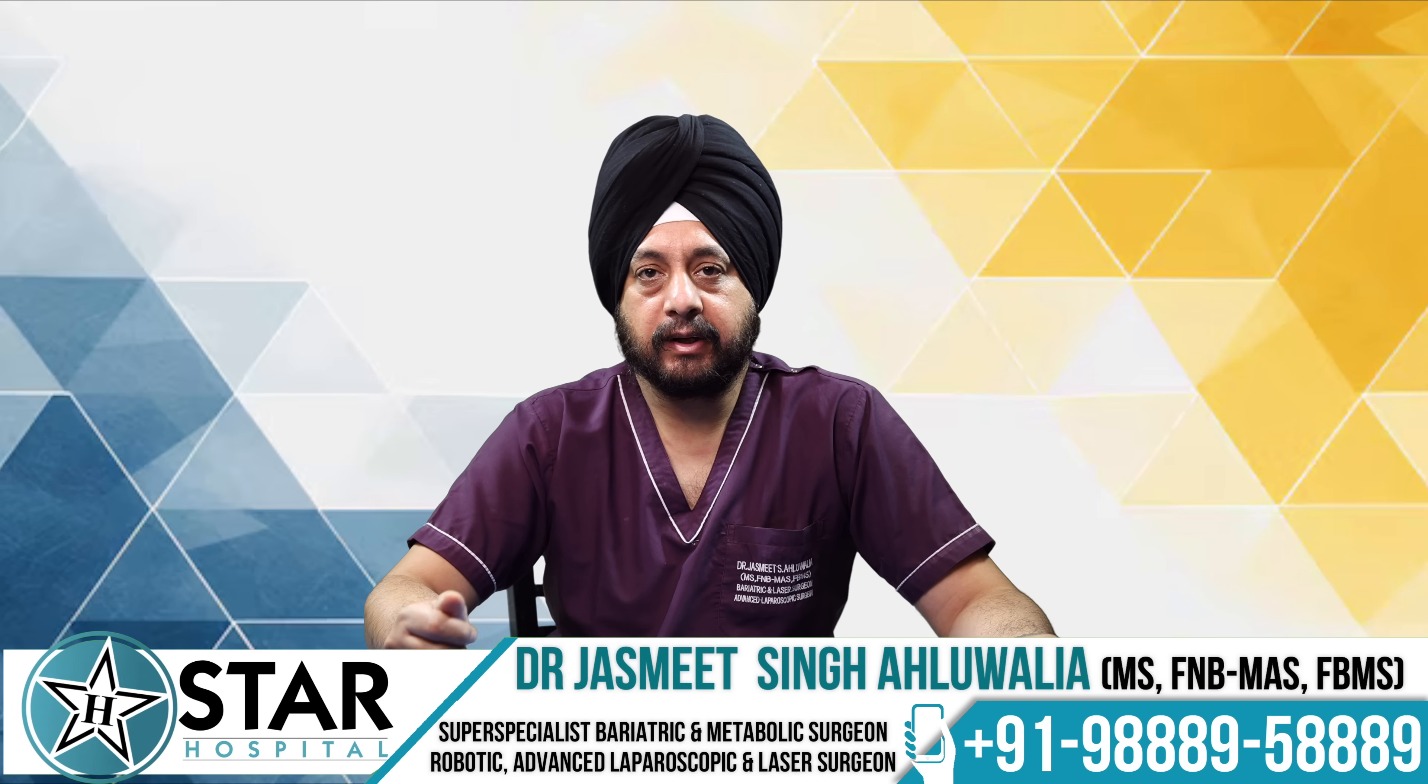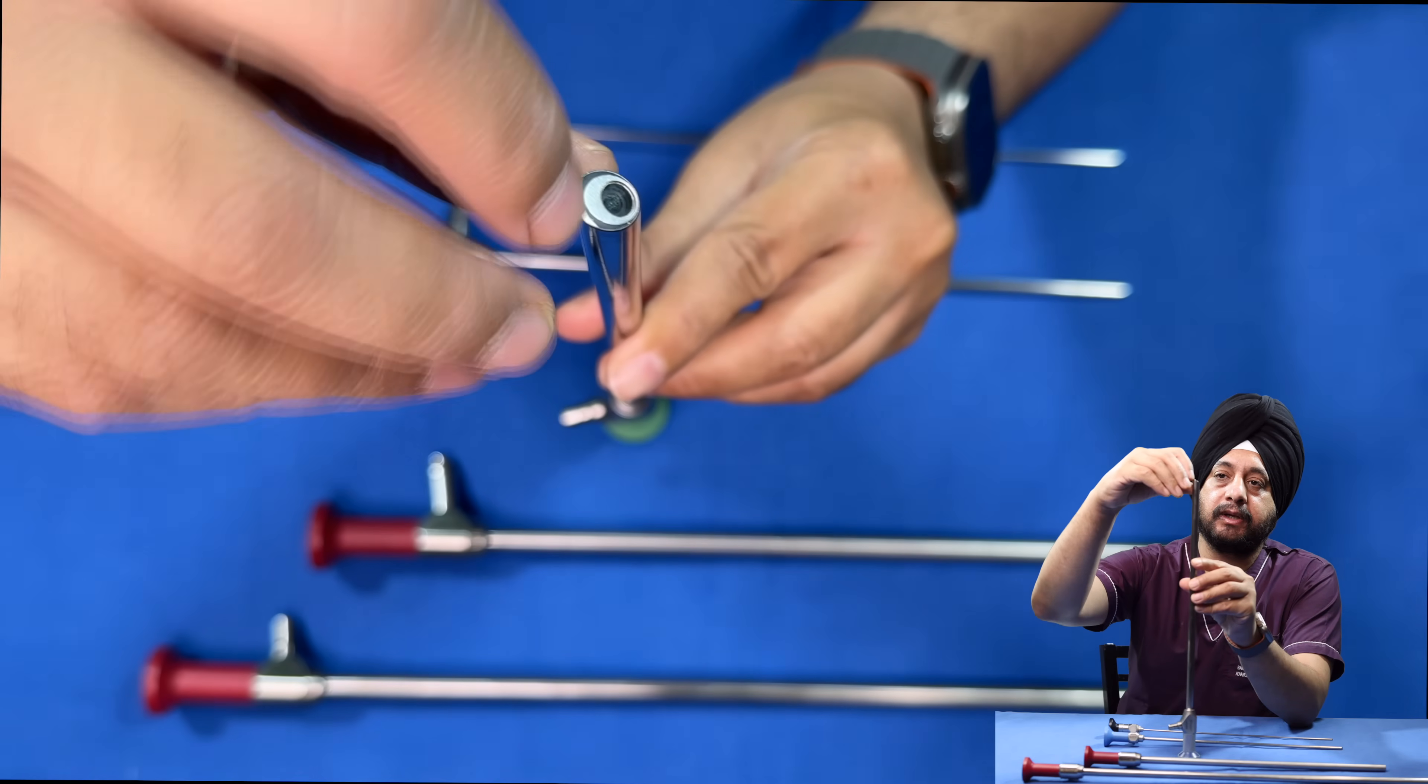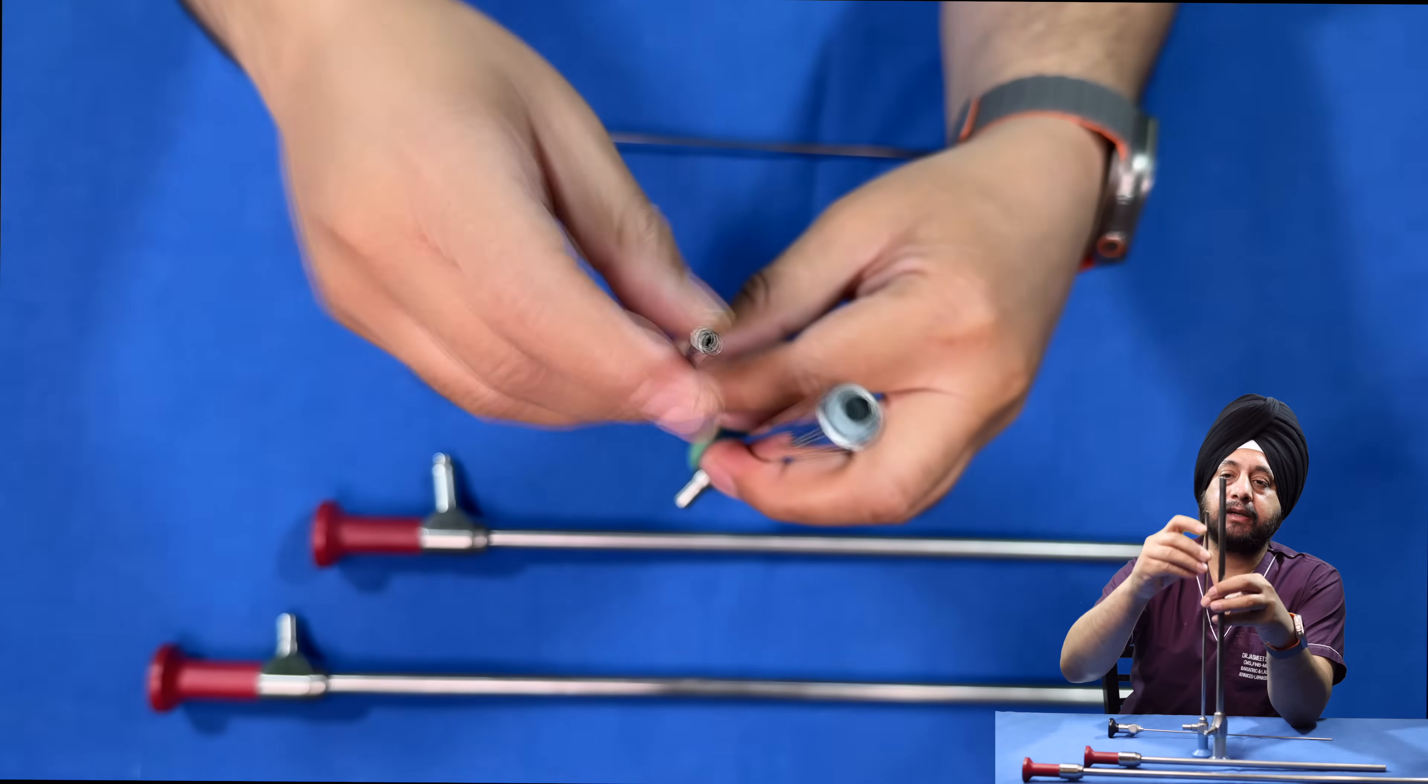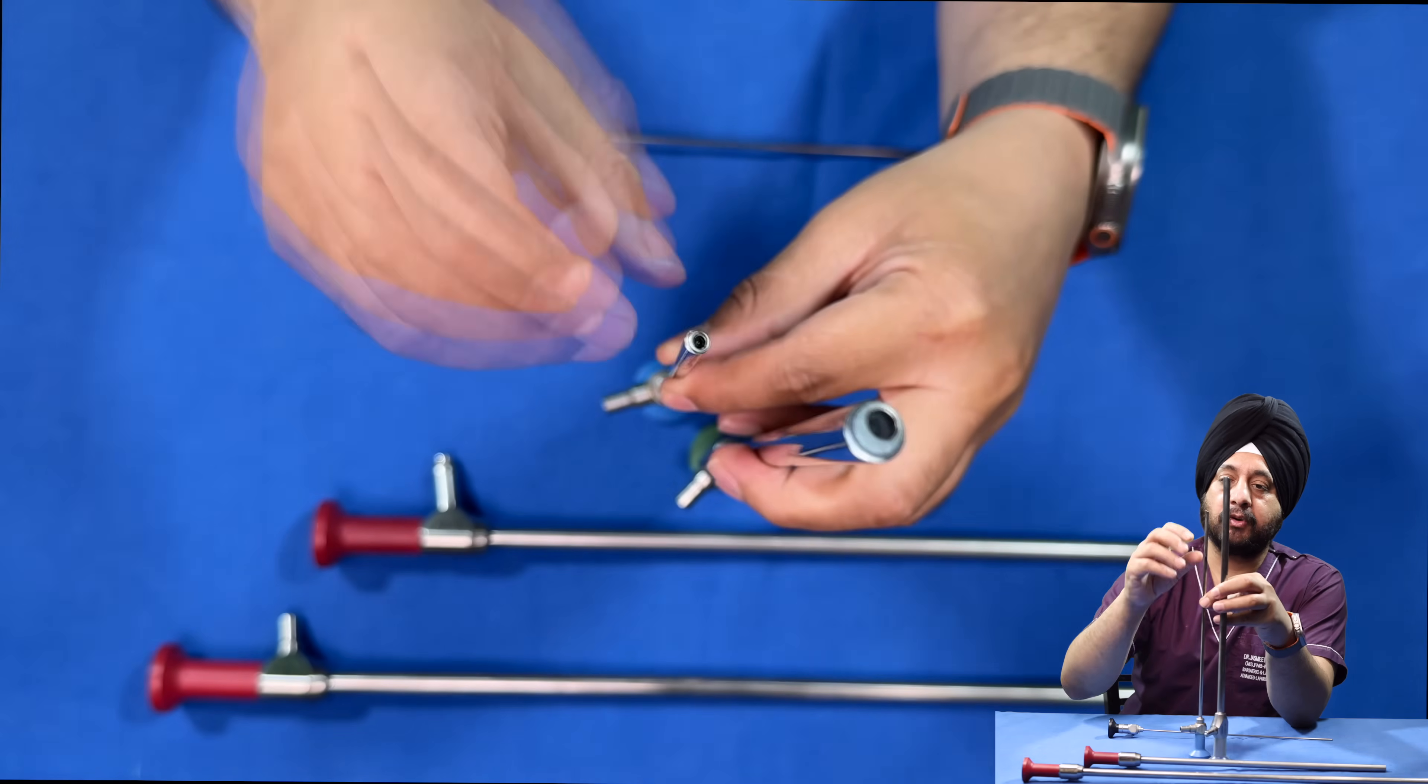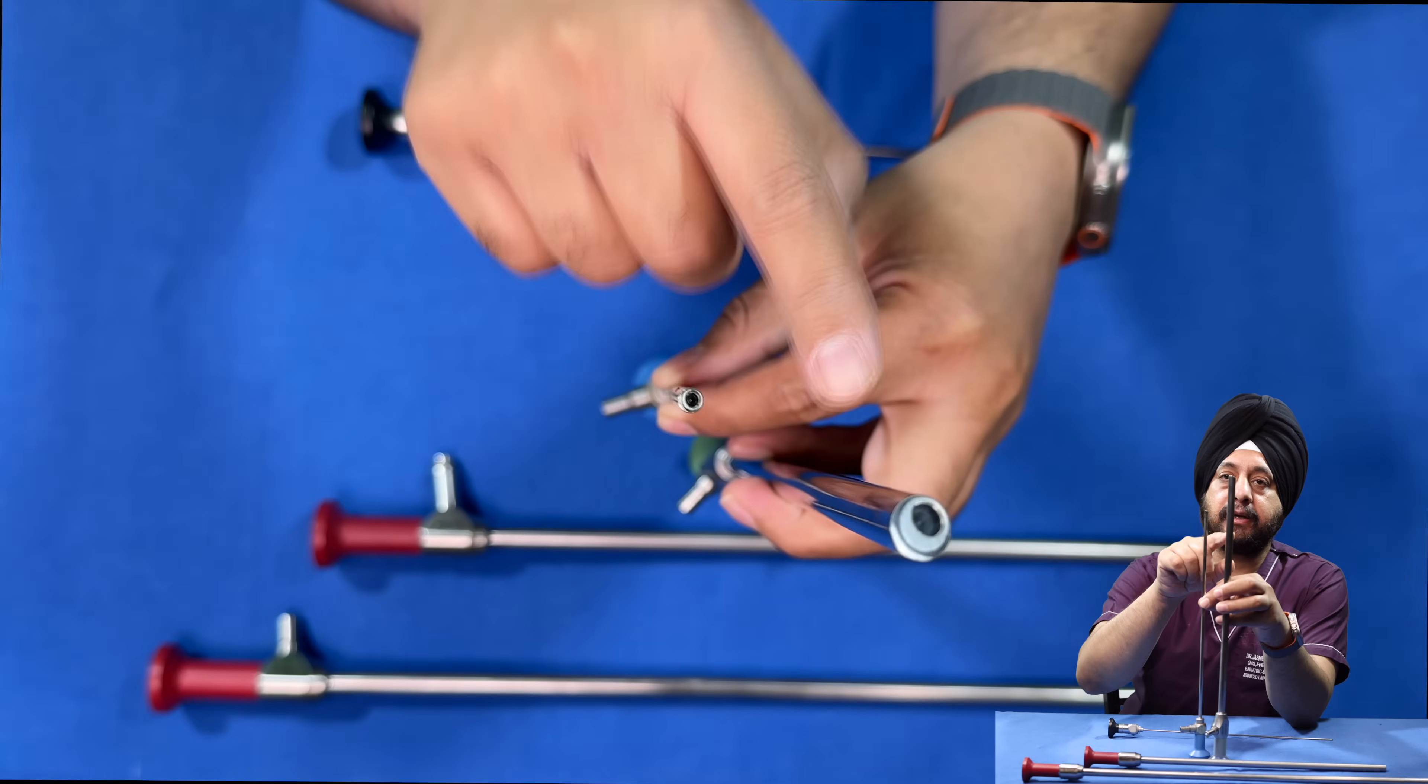The bigger diameter of the scope allows more light to come back, thereby giving you the best possible image. With a 10 mm scope, the aperture or outlet for the light will be much bigger as compared to a 5 mm scope. The 5 mm scope has a smaller outlet and conducts less light.